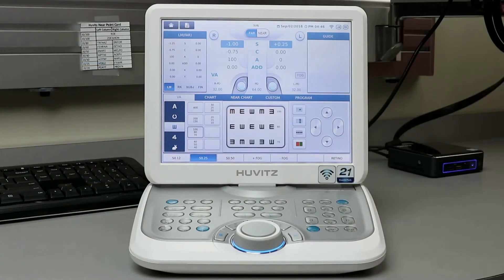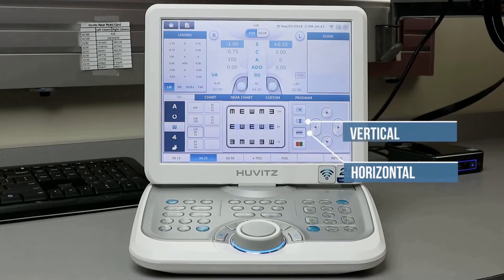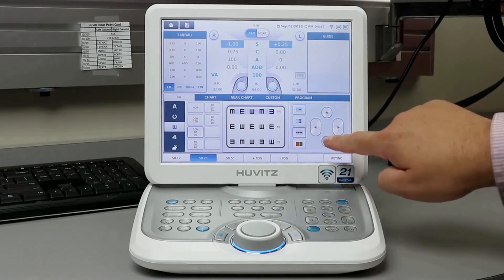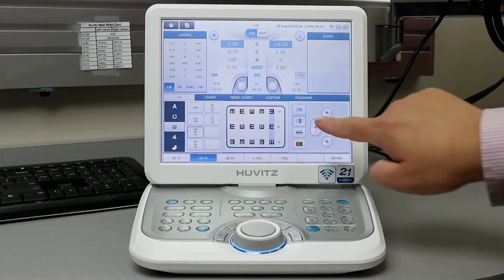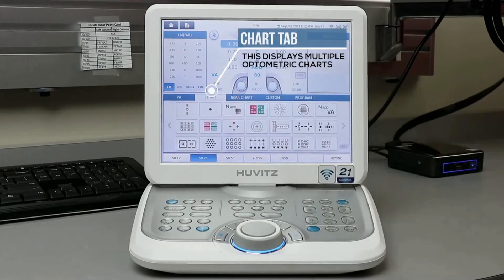To the right-hand side, you will have options for masking — there's horizontal, vertical, and single unit. To the far right-hand side, you can use the arrow keys to scroll through these options: up, down, left, and right.